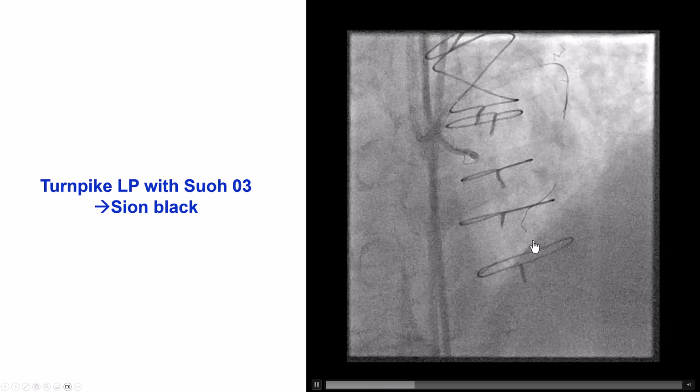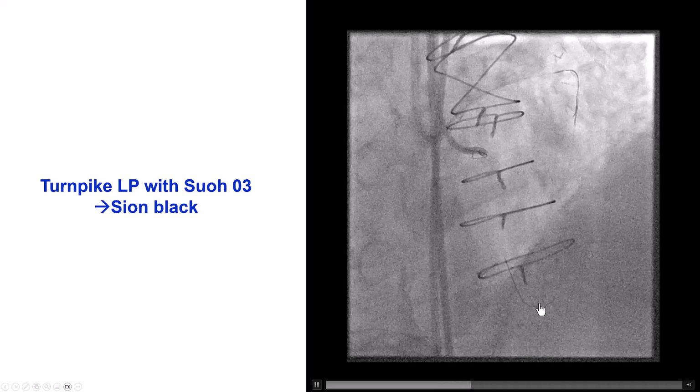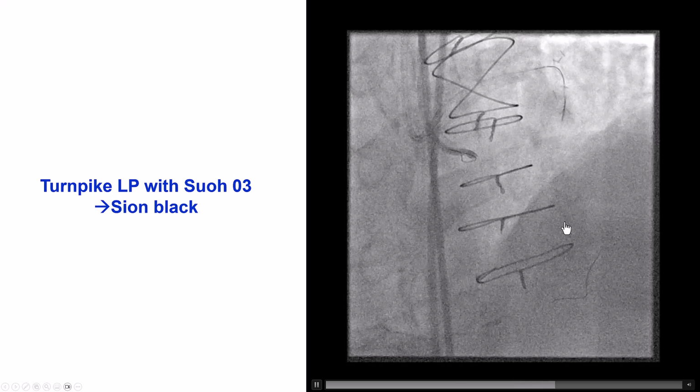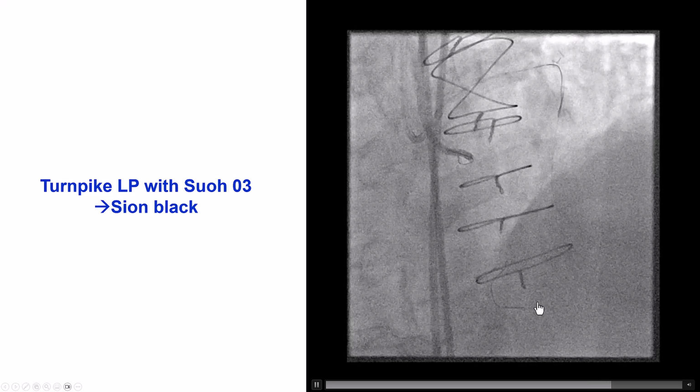And here is yet another one. Sometimes the septal collaterals can be fairly tortuous, and the wire may follow an unanticipated course. Typically, we want to see the wire go towards the apex and then turn back up. This is the most common course where the wire is going.